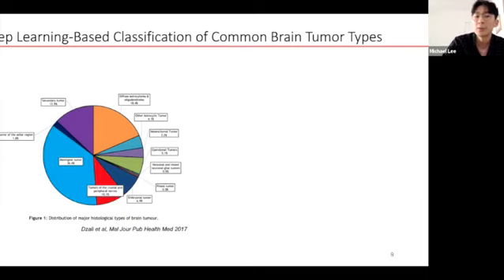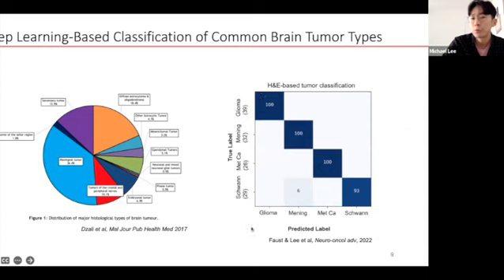When we tested this to see how it performed in classifying our 4 most common brain tumor types, we got this confusion matrix. We had a sample of around 120 or so whole slide images, ran them through this newly developed histomorphologic classifier, and the only errors were 2 whole slide images of schwannomas being misclassified as meningiomas over here, most likely due to looking a lot like meningiomas with spindle features. Oftentimes meningiomas and schwannomas could look pretty similar. So these were errors, but errors that made sense.